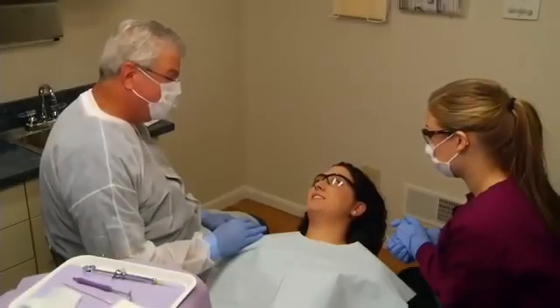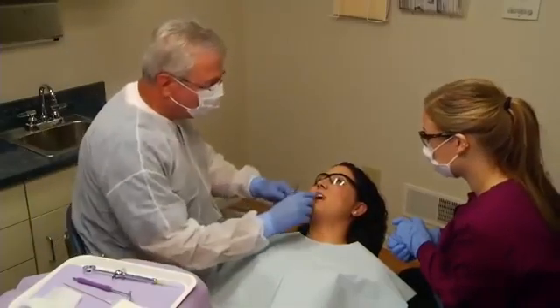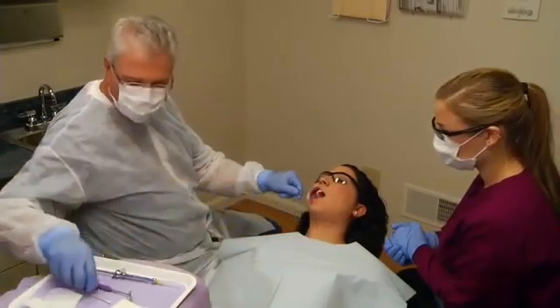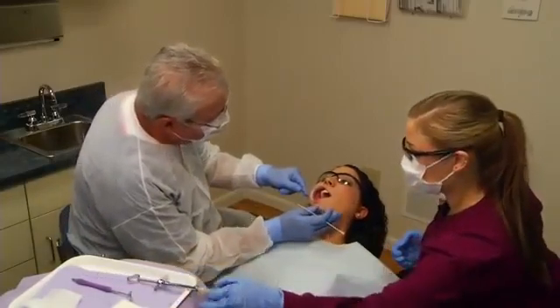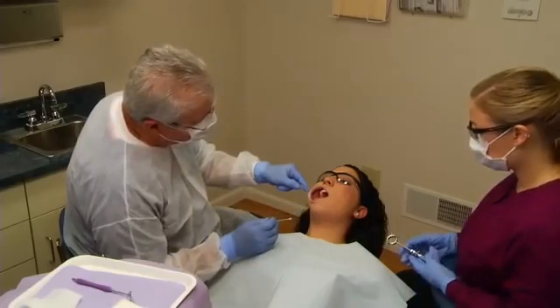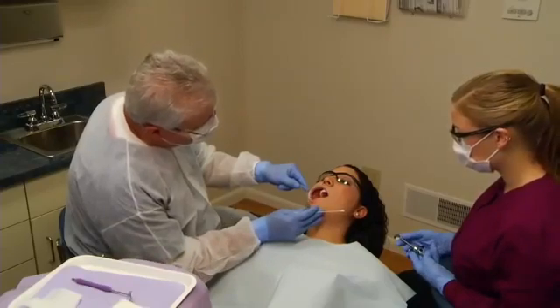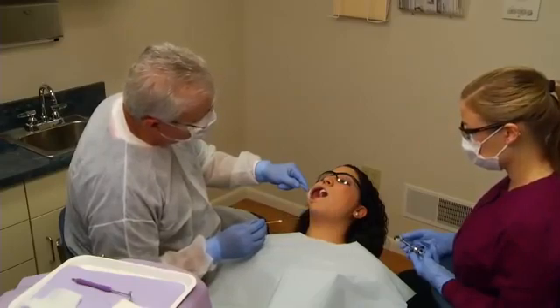For a right-handed operator performing a right posterior superior alveolar nerve block, the clinician may be seated in the 8 o'clock position, with the patient's neck extended and the head turned to permit visualization of the maxillary buccal vestibule. To perform a left posterior superior alveolar nerve block, the right-handed operator should sit in the 11 o'clock position. This maneuver relieves tension on the cheek and moves the coronoid process away from the injection area.